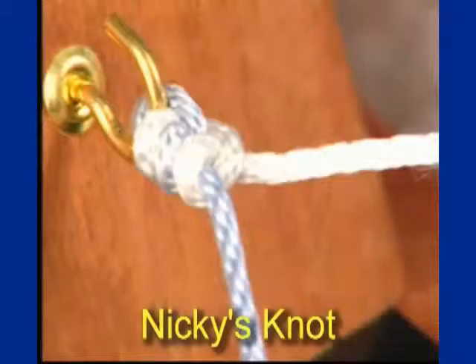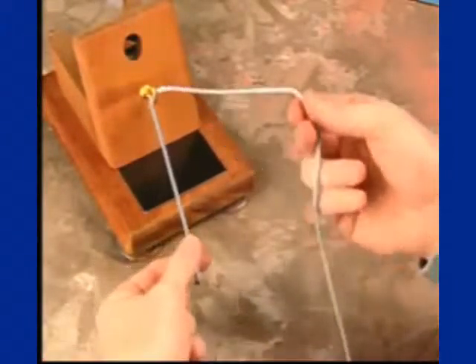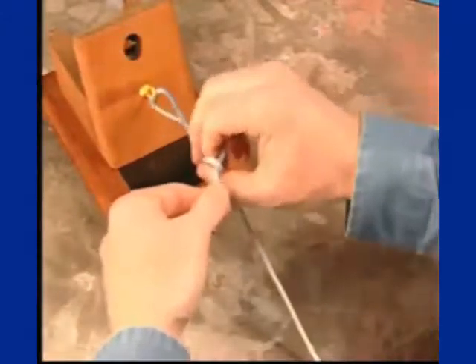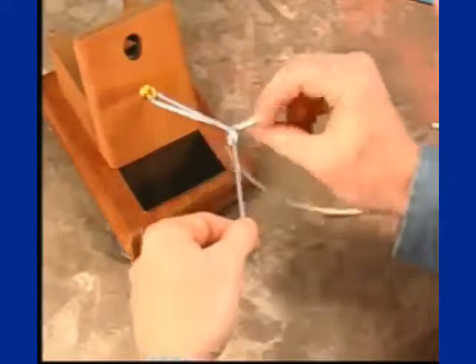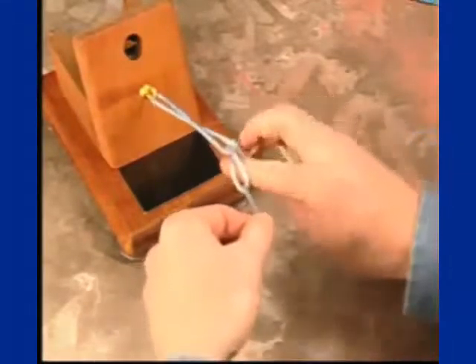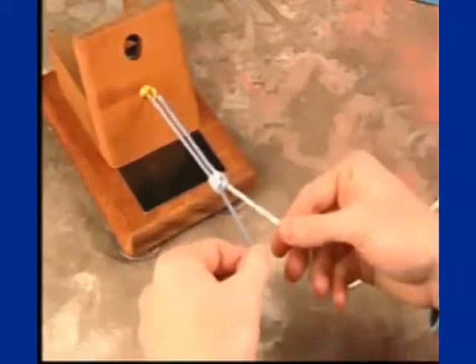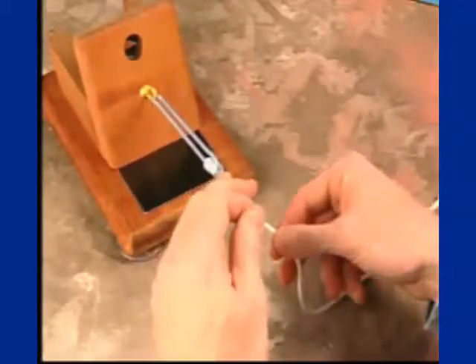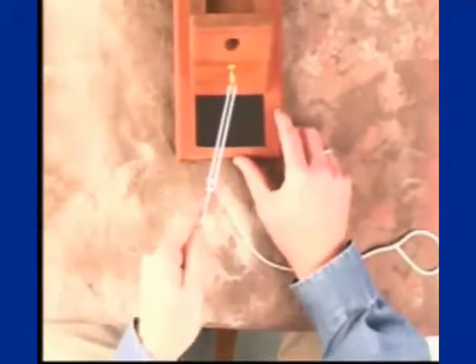This is a demonstration of Nicky's knot, a modified taut line hitch. The post limb is one half the length of the loop limb. An initial overhand throw is placed, followed by another overhand throw. A final overhand throw is then placed behind the first two. This is lightly secured on your post limb, and with back tensioning, the knot is slid into the joint, securing the tissues. The knot pusher would assist in pushing this knot into the joint.